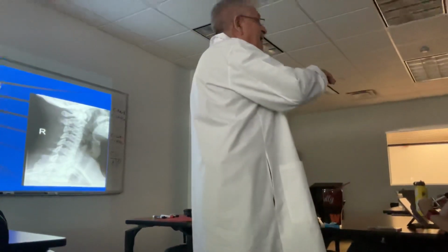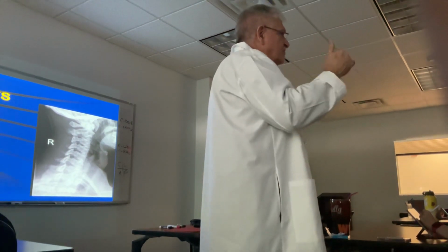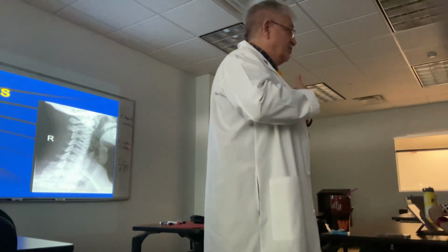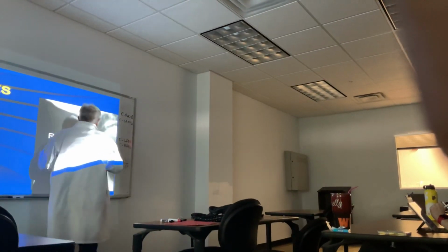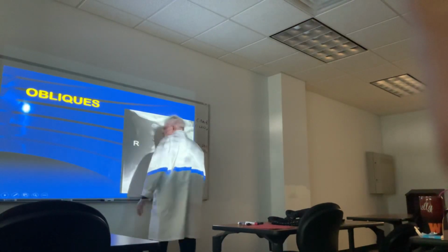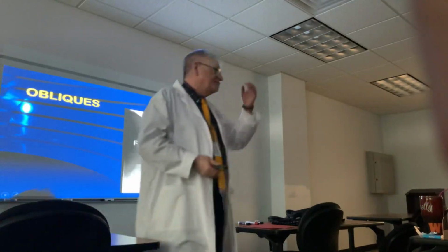You can flip the X-ray on the digital systems. Now it gets another layer of challenge, right? But we always follow the convention. Was the chest against the wall? It's anterior, hasn't changed any. And if I'm standing like this, which marker should this have been? Left. So this picture was flipped, or we don't know. We don't know. Okay, got it.